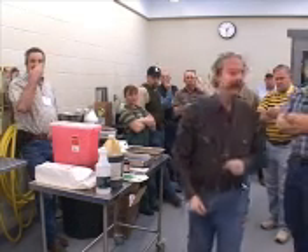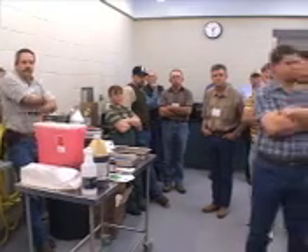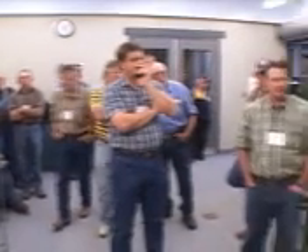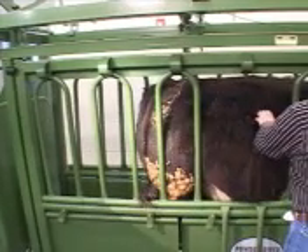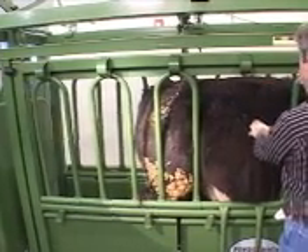The procedure is very, very straightforward. I always just come to the back of the animal, and I come about a third of the way down.